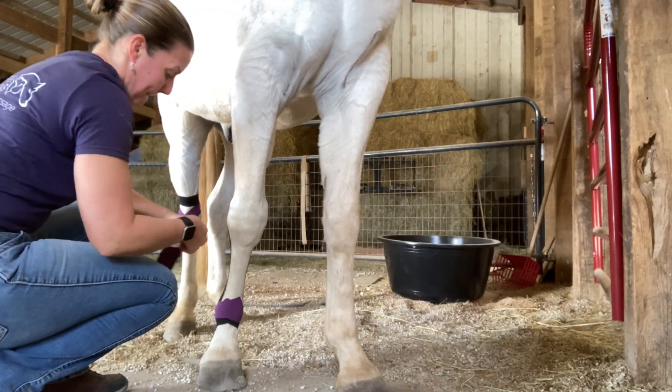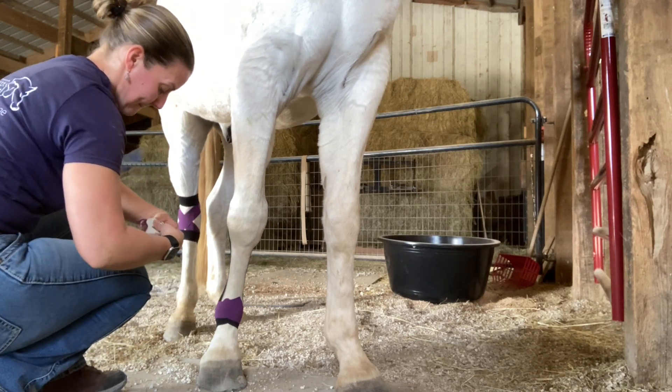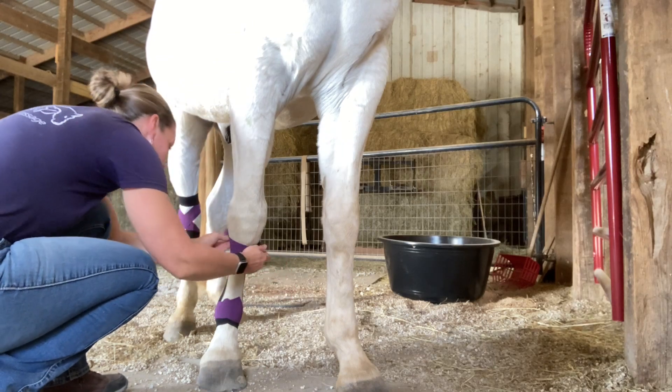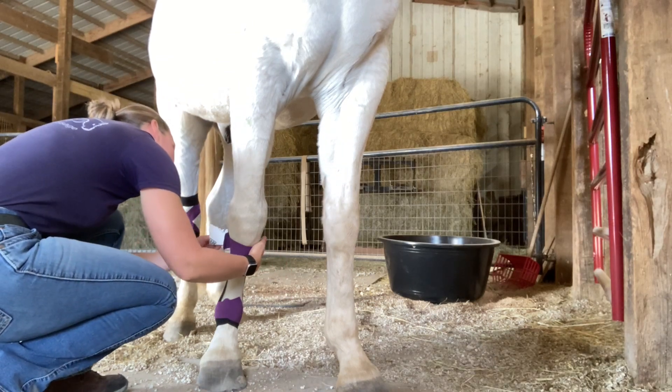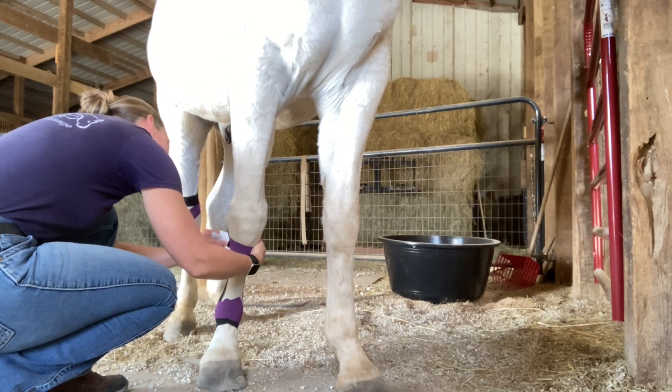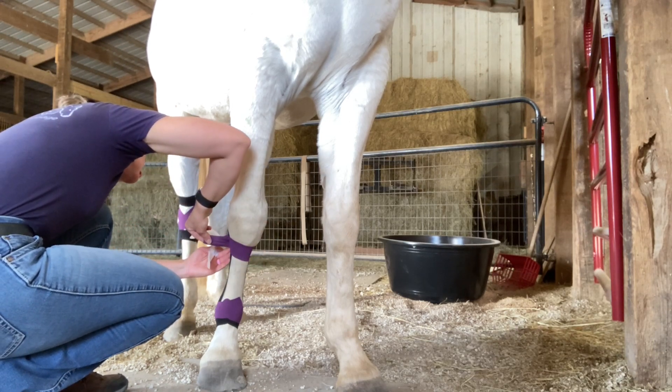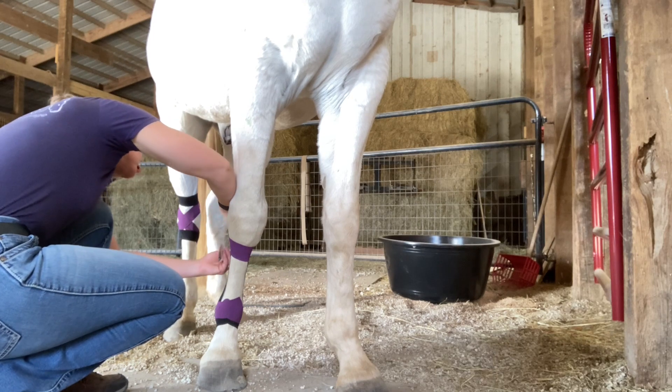Lastly, you're going to use an anchor. This anchor has been measured to fit around the top of the taping, just below the knee. No stretch — anchor pieces are no stretch. No stretch on the ends; overlap them. Give everything a good rub, and you should be good to go.